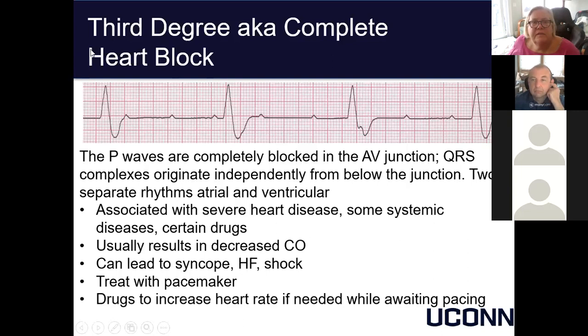So here is a third degree or complete heart block. P wave, P wave, P wave. You see the P waves very clearly. You see QRS complexes equally as clearly. They are wide, grossly prolonged, but you also see that there is no relationship between the QRSs and the Ps. The Ps are not causing the QRS response.